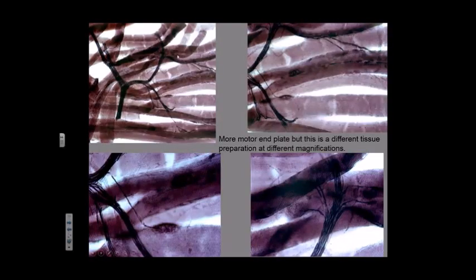And here's more of the same. Now these are wires coming in with multiple axons, branching and branching and branching, and finally branching into one where it's innervating one muscle cell, which is pretty cool the way that looks.